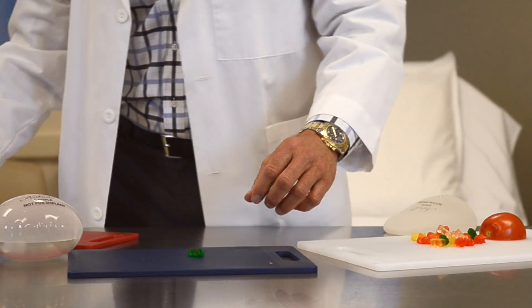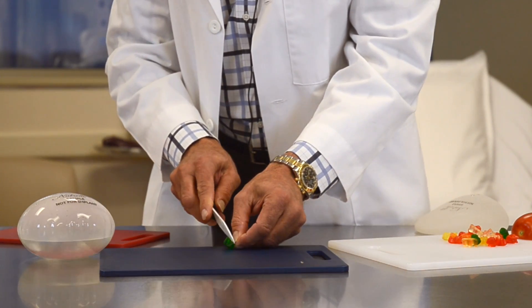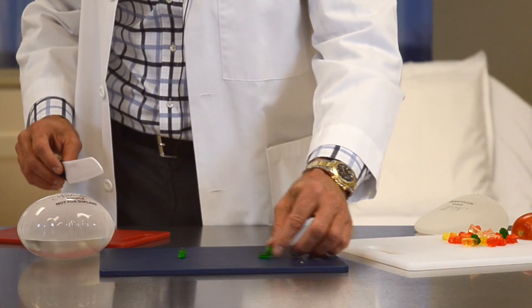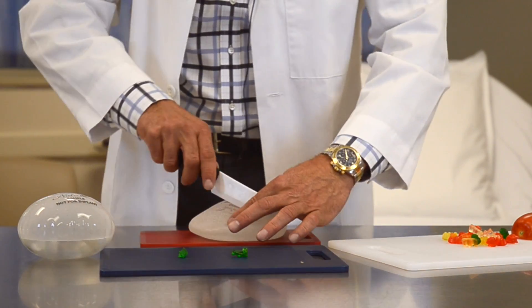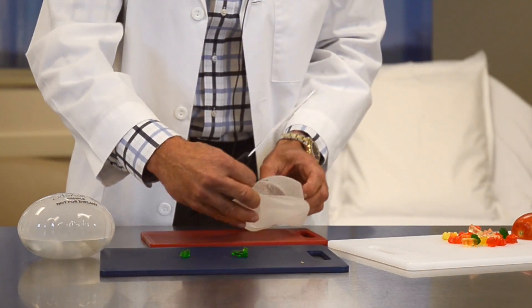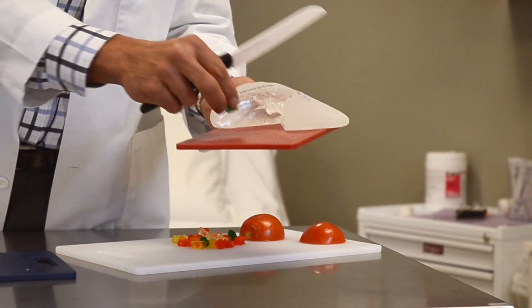Here's a little gummy bear candy, and if I cut this gummy bear candy in half, I have two halves of a gummy bear and it sticks together — it'll stay there just like that. If I take the gummy bear implant and cut it in half, I can split it and lay it right on the table and it's not going to leak, because this is relatively solid material, much like the gummy bear candy.